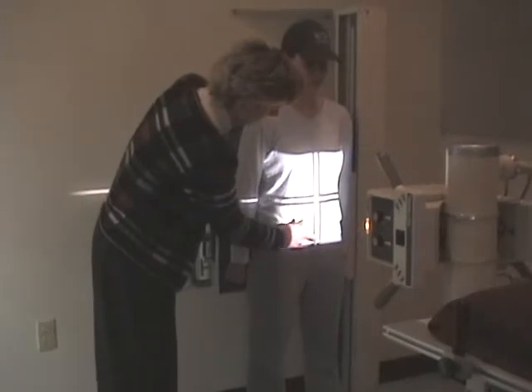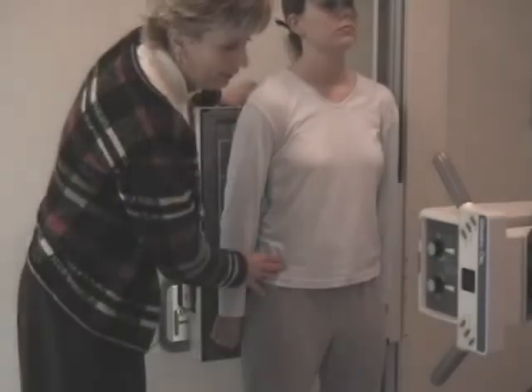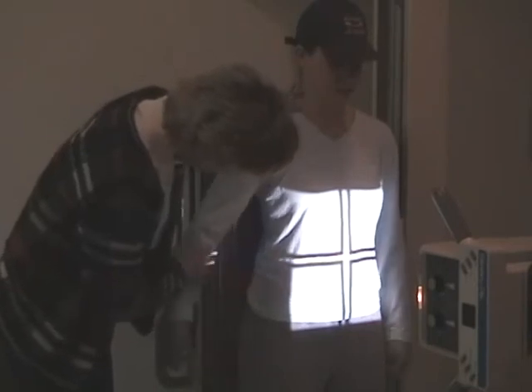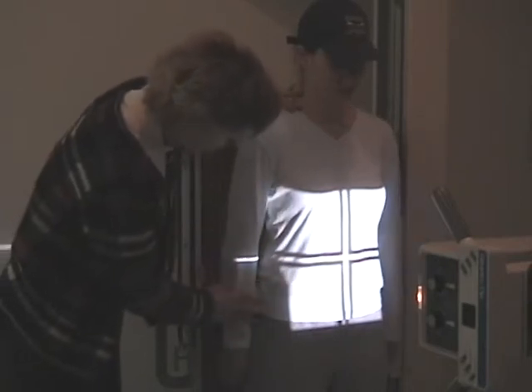I just double-checked that the MSP was to the center of the film. She's not rotated. She's facing the board straight. I have a 14 by 17 collimation. If the patient is tiny, you could collimate side to side, but I don't have an excessive amount of collimation, so I'm going to leave the 14 by 17.